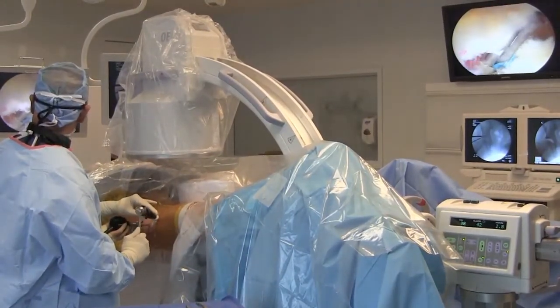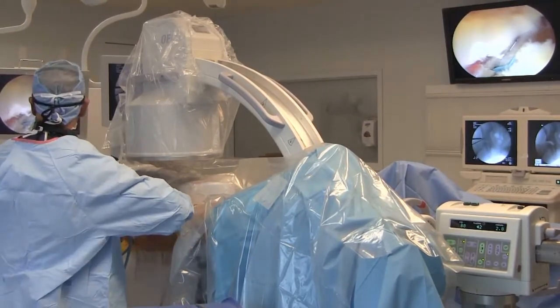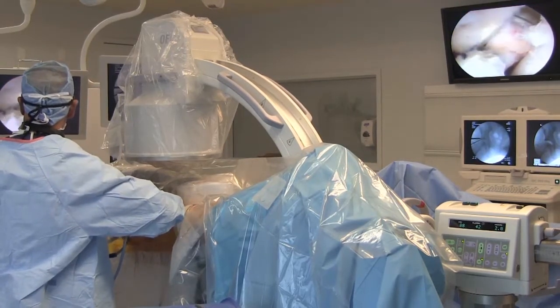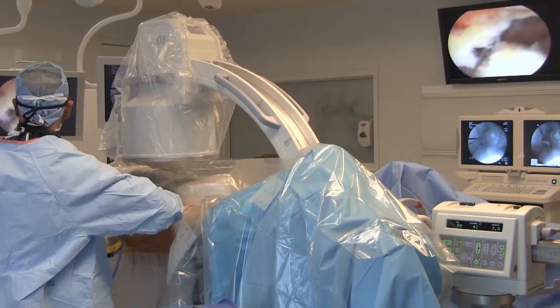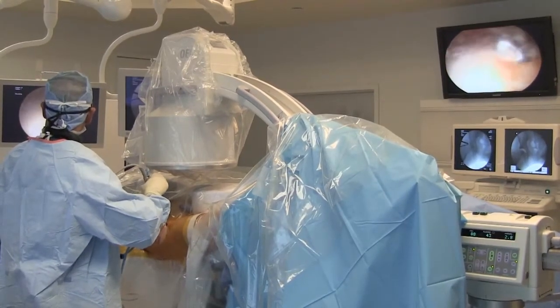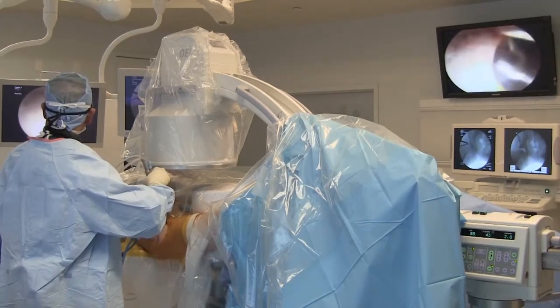Once arthroscopic labral refixation or reconstruction is performed, traction is released to confirm the labral fluid seal as well as to perform femoroplasty. Cam decompression is performed through the small vertically oblique capsulotomy connecting the anterolateral and modified mid-anterior portals.